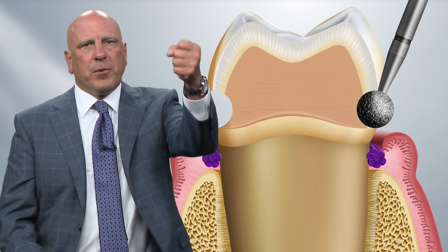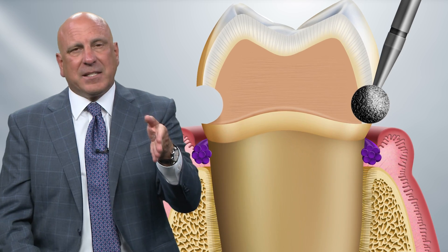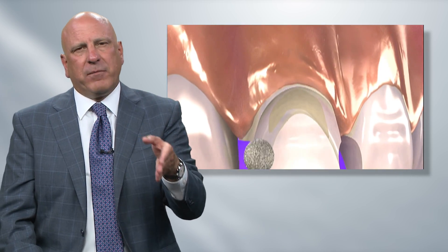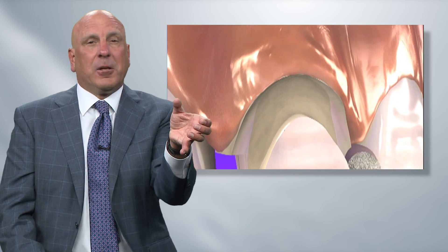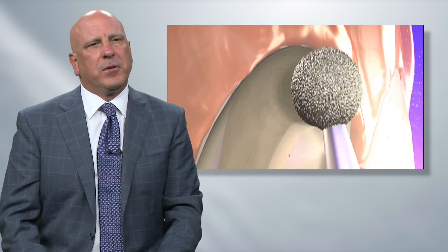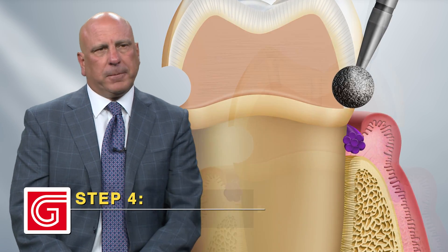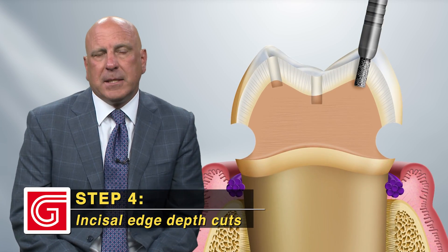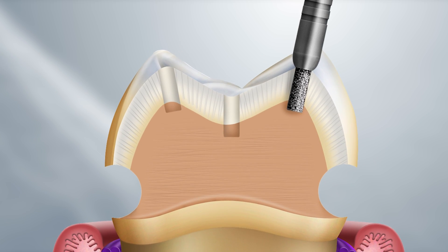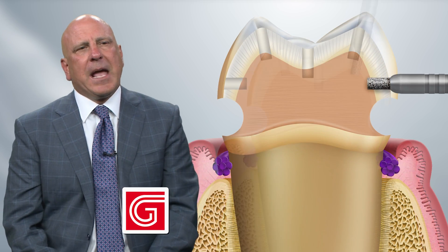Anytime you hold that round burr parallel to the long axis of the tooth, the shank of the burr acts as a self-limiting depth cutter. On anterior teeth, the head of the handpiece has to be held away a little bit, which angles the burr more — that's good, it gets it to its full depth. Make your margin preparation on the buccal and the lingual with your round burr, then place your depth cuts in the central groove and the lingual cusps. For the first couple of times, just do the two buccal cuts to say that you did, so you end up with all your depth cuts on the occlusal.